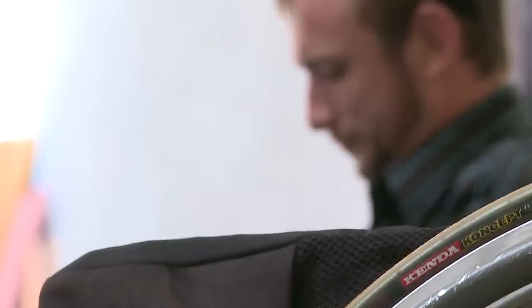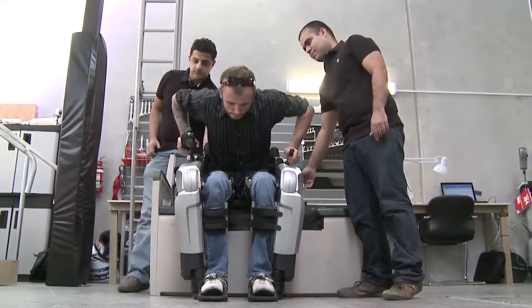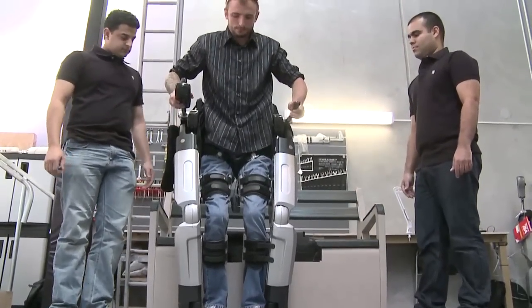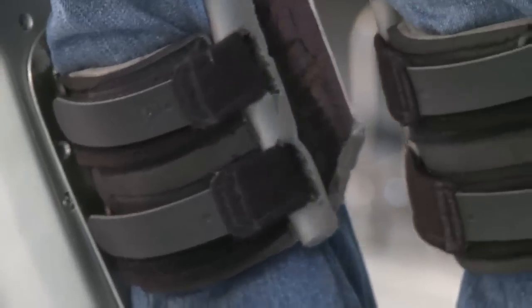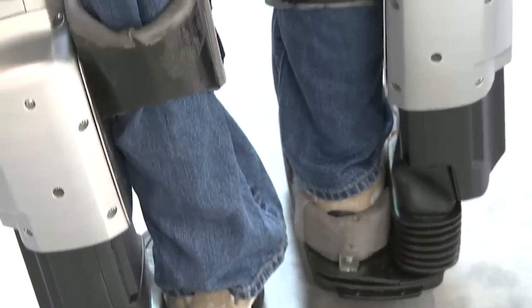The experience of getting back onto two feet and walking around has been a really big experience. It throws you a hundred million emotions all in one day that you didn't expect to go through. You think, okay, we're gonna get back walking, but you didn't expect it to take your breath away the way it does. You go home after a good session and all these possibilities of what you're going to be able to do again just keep coming back to you. It's really emotional but really fantastic at the same time.